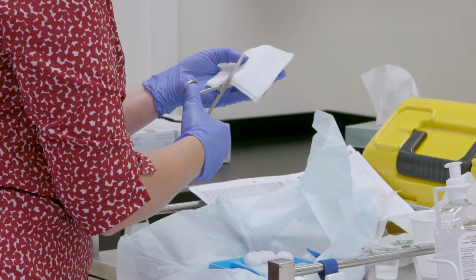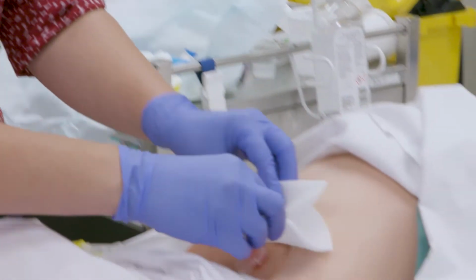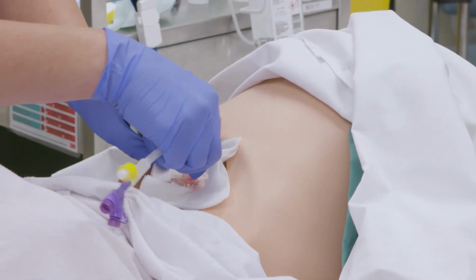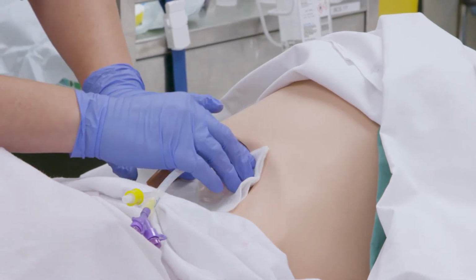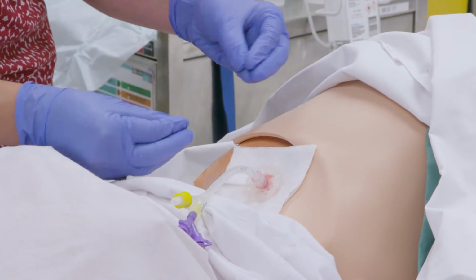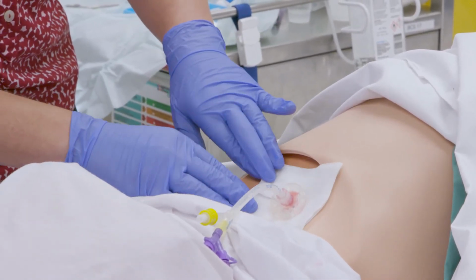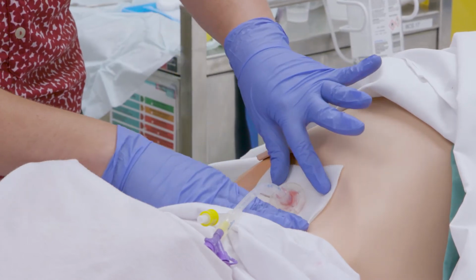Cutting of the trouser legs, and we would just place this around the tube, which would give Mary some comfort. It would minimise the damage to any clothing. It would absorb some odours. We wouldn't want to tape that too heavily, Mary, because we don't want to not allow your area to breathe.